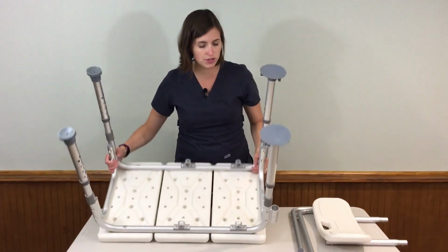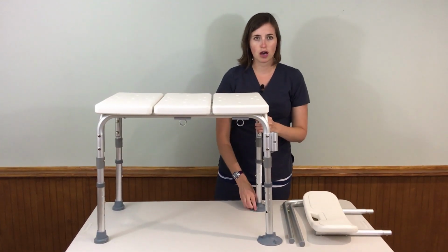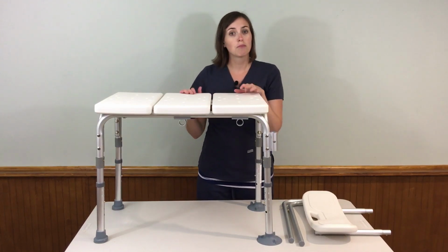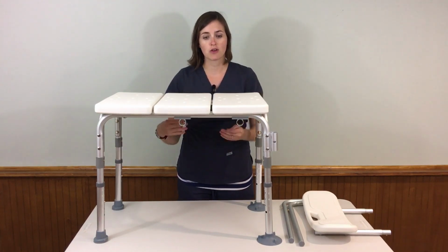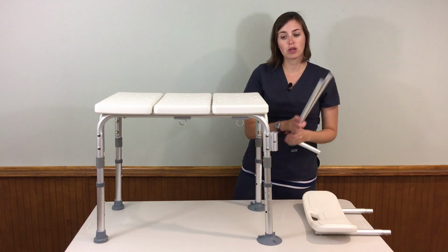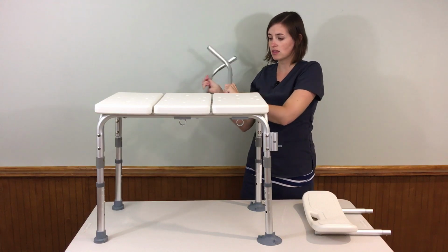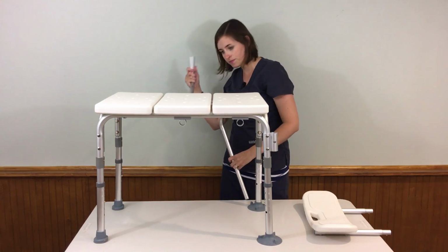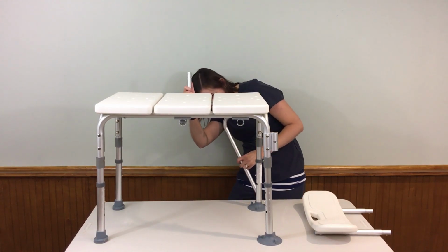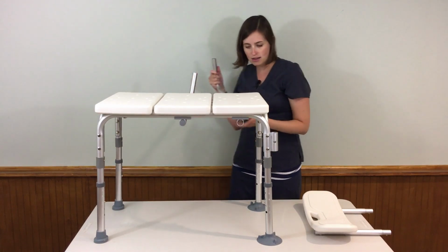Now I'm going to flip this over because we're going to install the backrest. Now this is important too. The backrest is always going to go on the same side as your suction cup feet because it's going to go inside the tub. The important thing to recognize is there are 4 of these rings mounted underneath. It's meant to be that you can go either way. You can slide it in this way to put a backrest facing this direction, or you can slide it in this way for a backrest facing that direction. So depending on, again, where your shower head is. I'm going to put mine on this side here. Again, single click button. It's going to slide in, should snap into place.